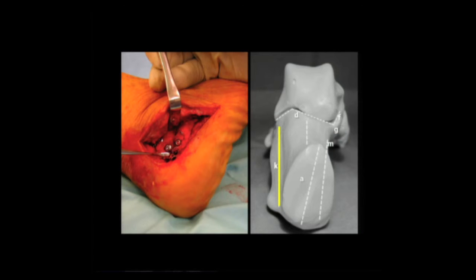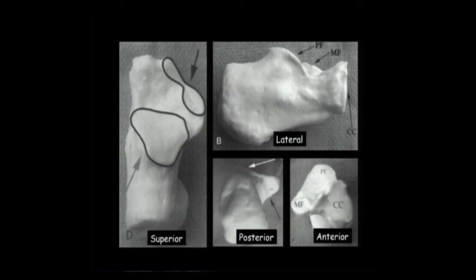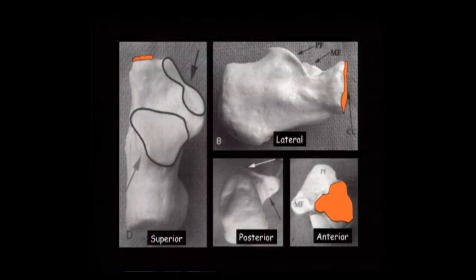On the lateral side, you can appreciate the lateral wall of the calcaneus is a rather flat structure. It's a common site for anchoring fixation constructs, low-profile plates and screws. And I'd like to draw your attention to the soft tissue envelope over the lateral side of the calcaneus, which is thin and needs to be managed very carefully to prevent wound healing problems and deep infections postoperatively. And then finally, the anterior calcaneal cuboid articulation is highlighted in orange, and while a bit more forgiving than the other joints, it's important to get this anatomically reduced as it is an articular surface.